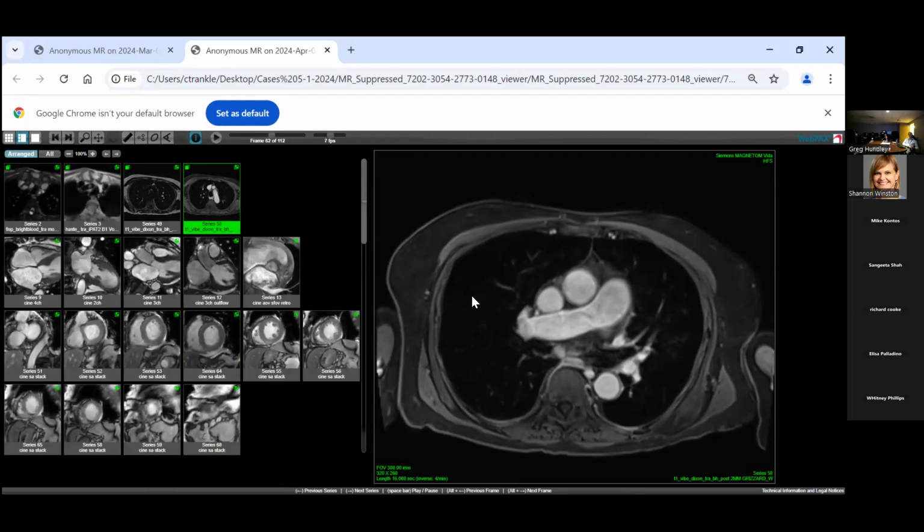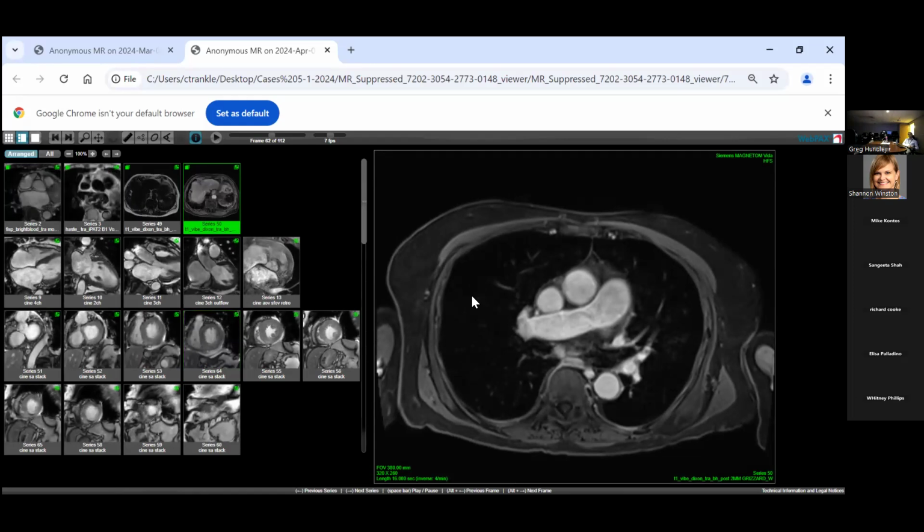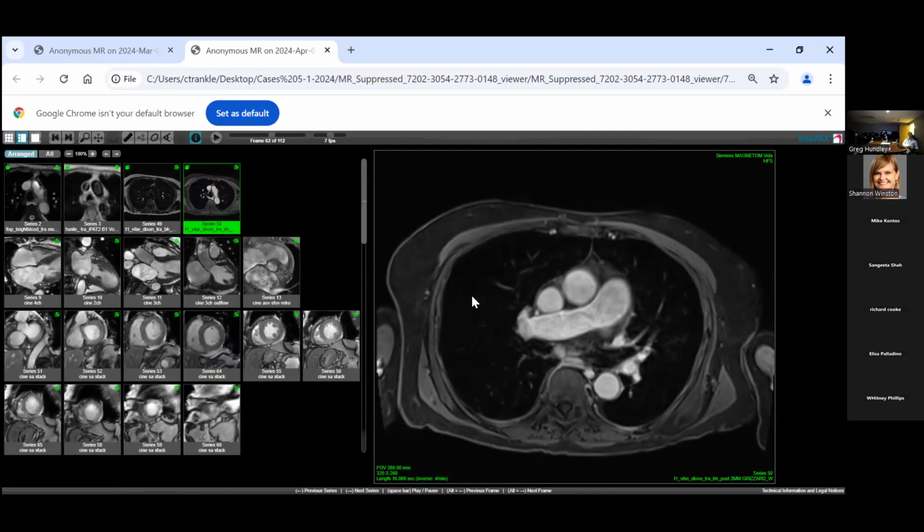We talked about what we needed to do to make a single slice, a single image 2 weeks ago. We talked about T1, we talked about T2, we talked about the protons and all that kind of thing. And we talked about spatial resolution and signal to noise, right?